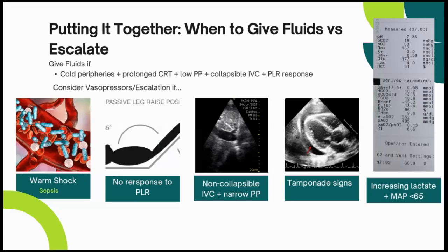That is why we ask for a blood gas during surgery, especially in a bleeding patient, because we want to get a better idea about our volume status. It is not only to look at the hemoglobin, not only for the electrolytes, not only for the oxygen and carbon dioxide. It is for the volume status. So it is a marker of volume response that you use during surgery.